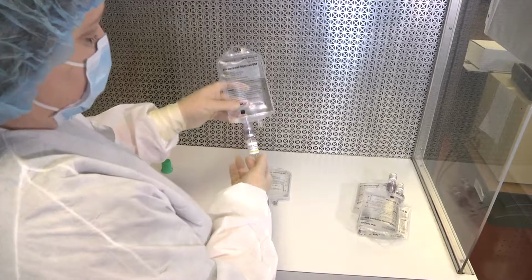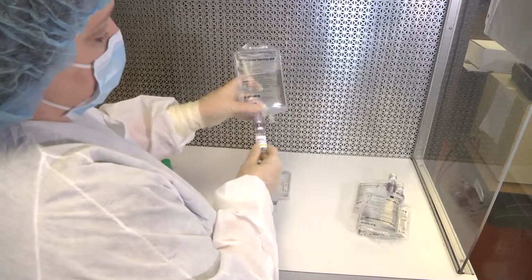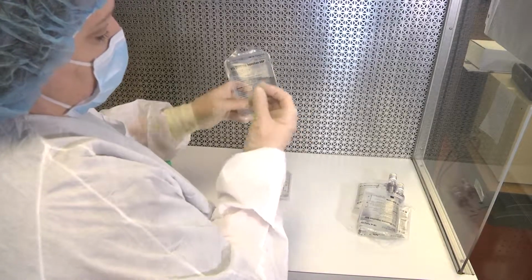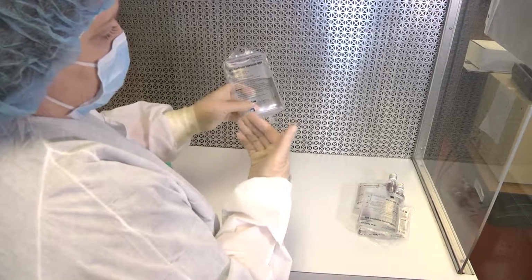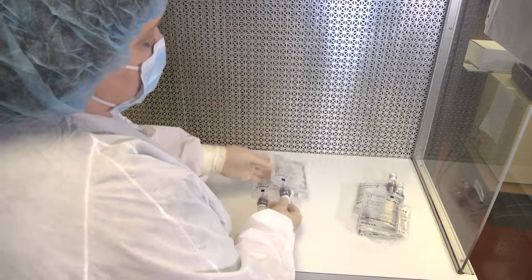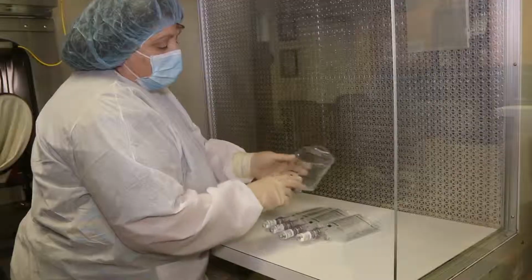So the two reasons it would leak is twisting this once it's already in the IV bag, and not spiking it correctly by having the eye of that spike looking at you and putting it straight in. Otherwise, this is a batch of Add-Ease IVs ready to go.